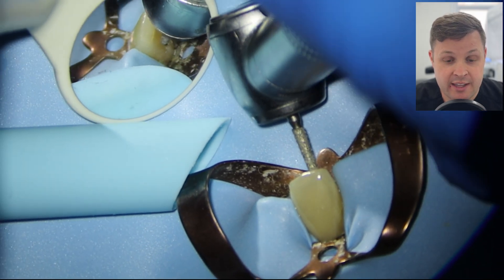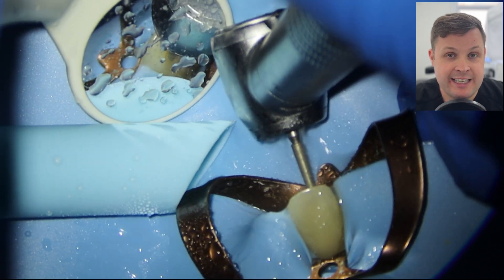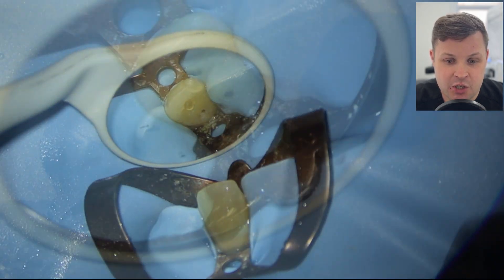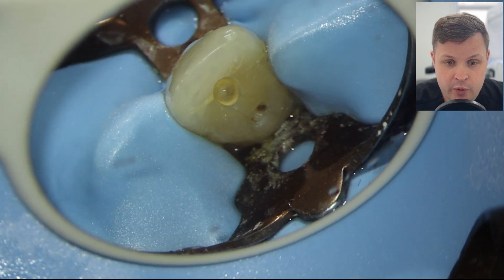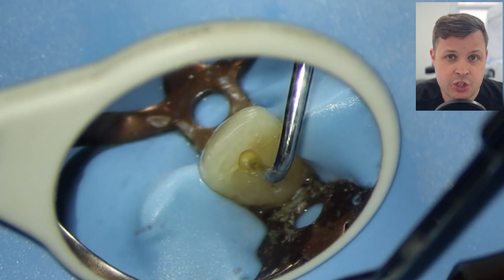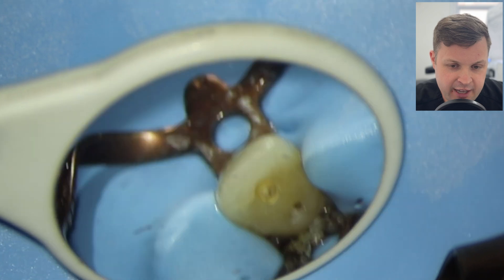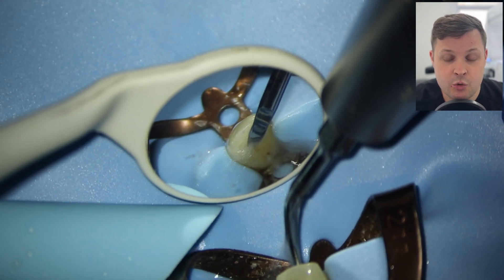When we are accessing the tooth, we want to think about the orientation of our bur — it'd be really easy to drill into the tooth and go out buccally. We've drilled in here and there's possibly some sort of exposure, so I'm going to use a DG endodontic probe just to have a feel around. It finds that it isn't an exposure.